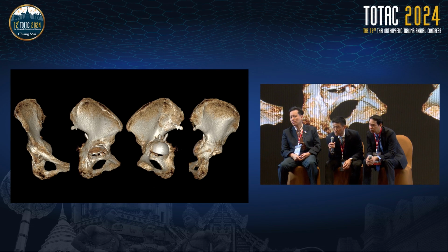So it's likely that the acetabulum is not stable enough for the prosthesis to stay, and in my opinion, I prefer to do bone grafting with a supporting ring, and might use a cemented cup.